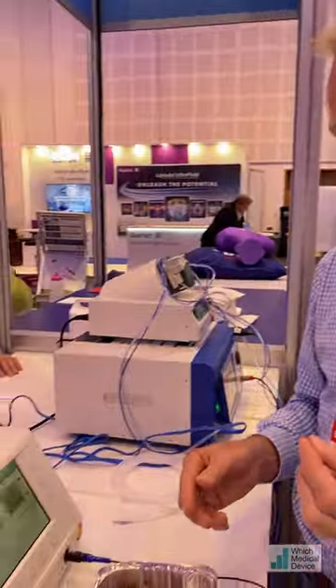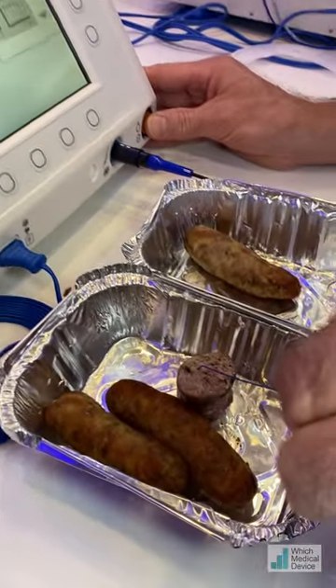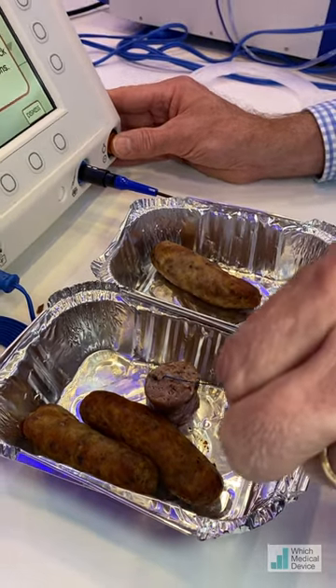This is the Baylis power wire, which is an RF wire on the end. You make a circuit with a generator here. I'm just going to demonstrate how it works — we're going to put it on this sausage, and you can burn little holes basically.